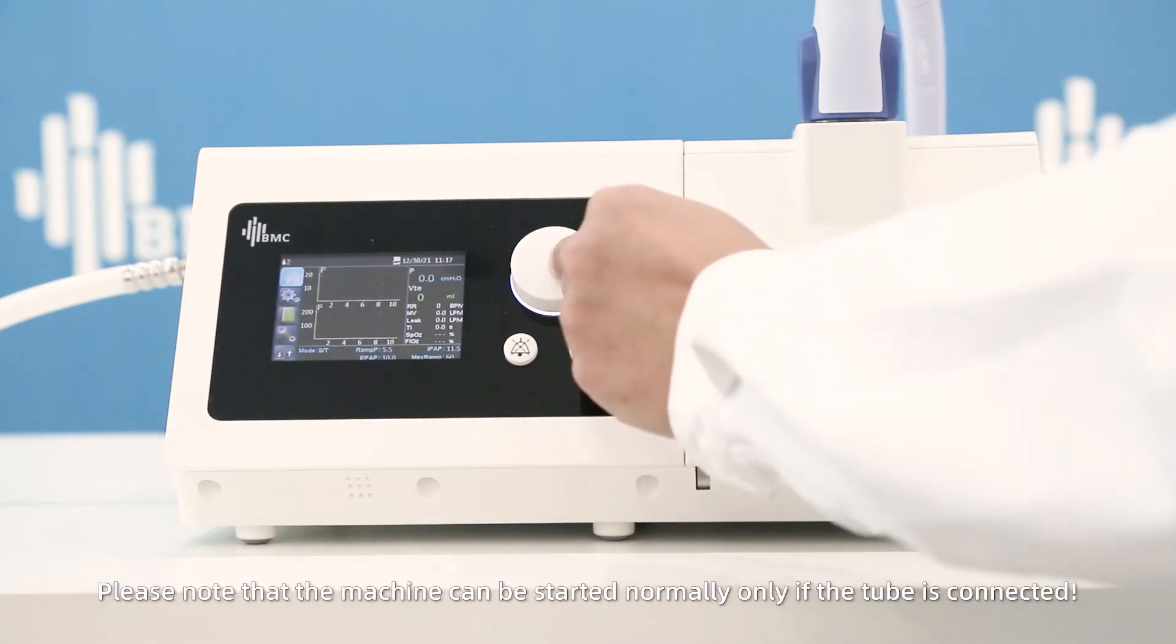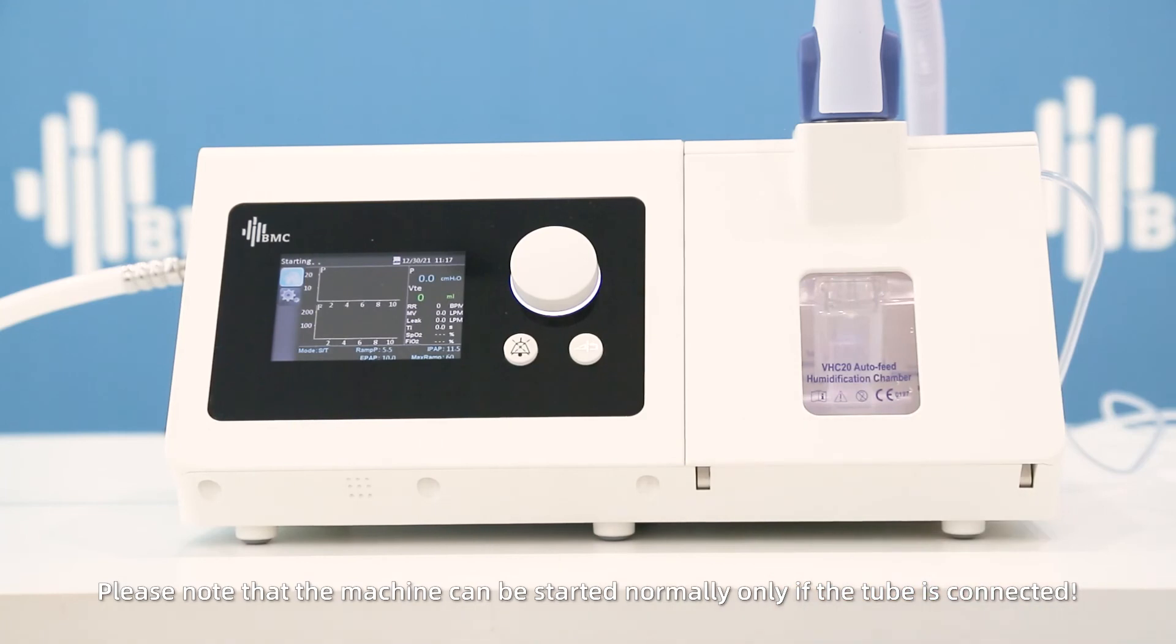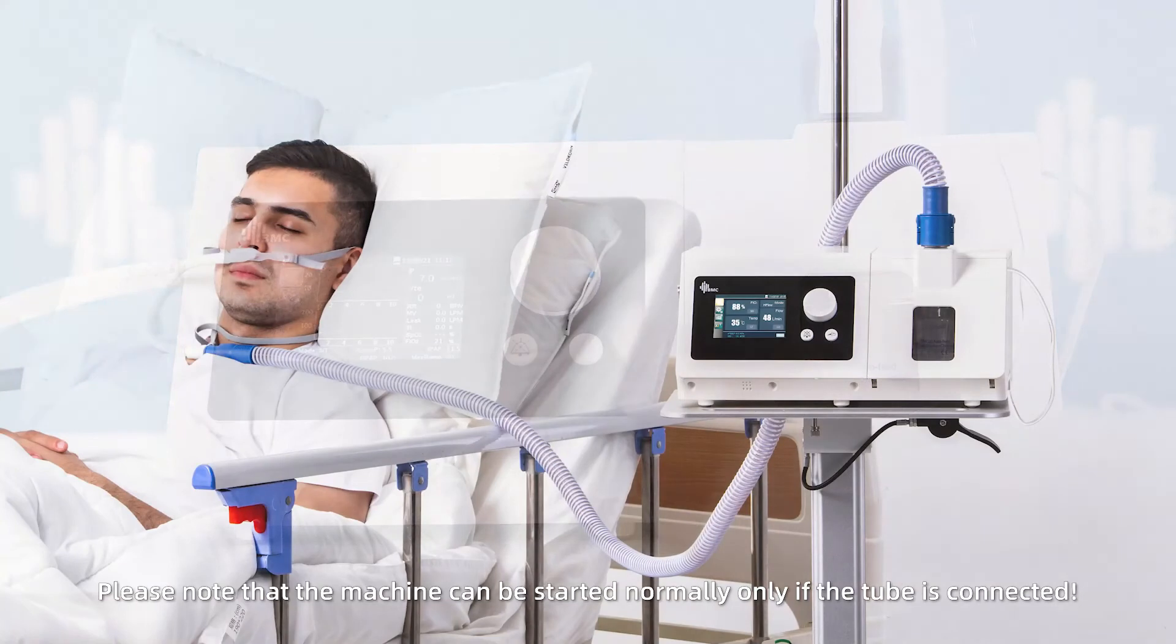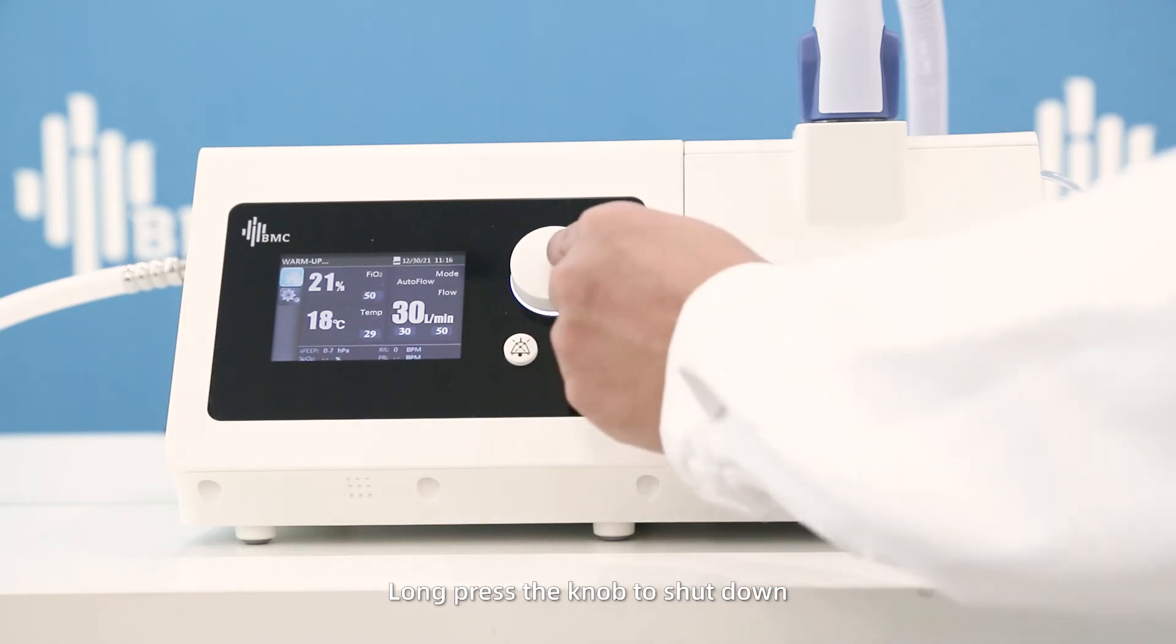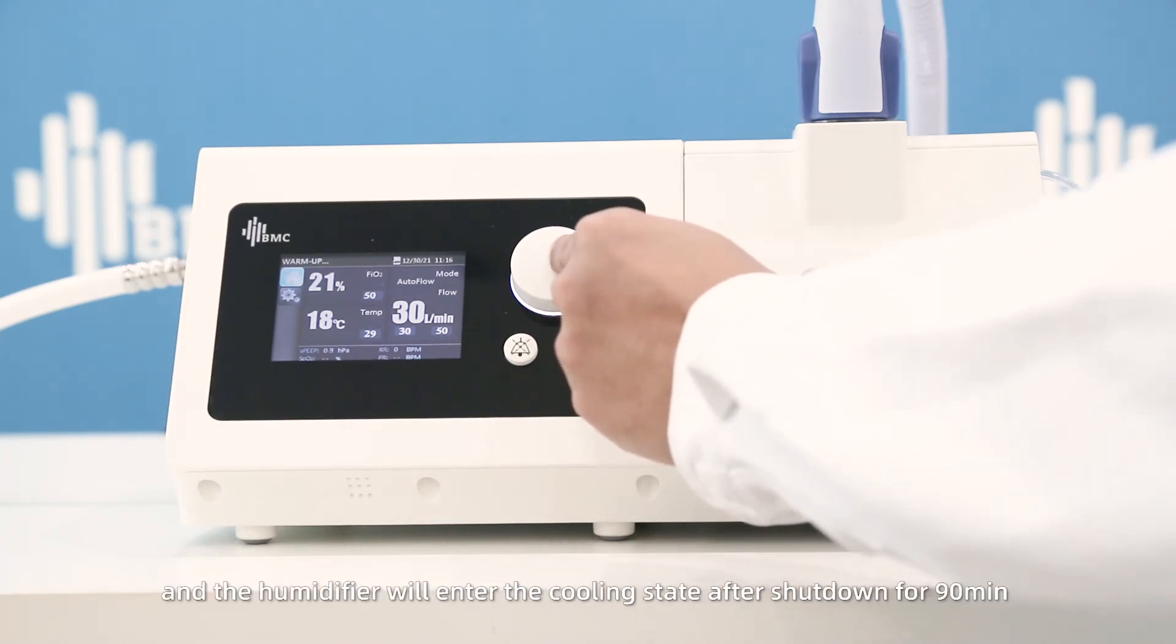Press and hold the knob under the non-invasive ventilator interface to start the machine. Please note that the machine can be started normally only if the tube is connected. Long press the knob to shut down, and the humidifier will enter the cooling state.